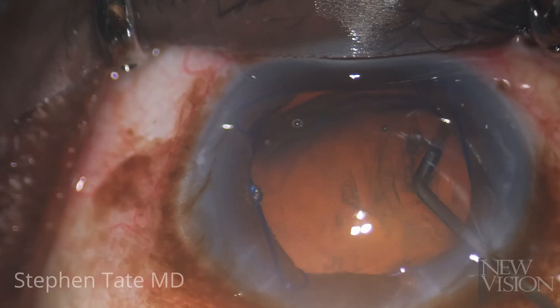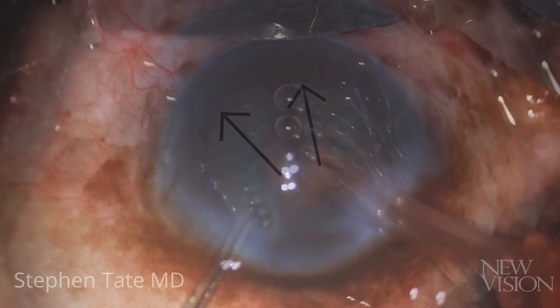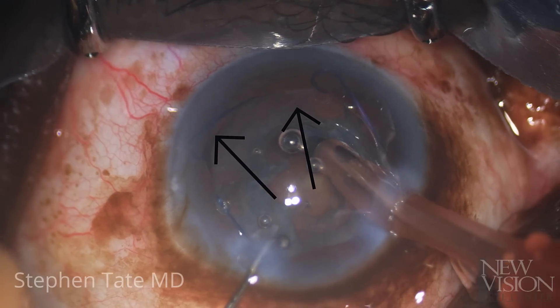I decided to bowl out the nucleus in the bag, being careful to direct any gentle force opposite the so-called ears of the lens to avoid displacing the capsule.